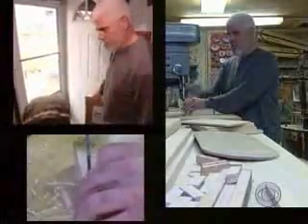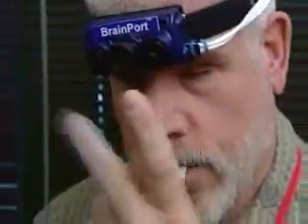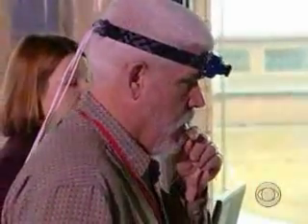At first glance, Roger Bain looks like an independent guy who loves his power tools. And he is. But here's what he's actually seen since he was a young man. But part of his world is slowly coming back into focus through experimental technology called BrainPort. One day it could actually help blind people see, in a sense, using their tongues.